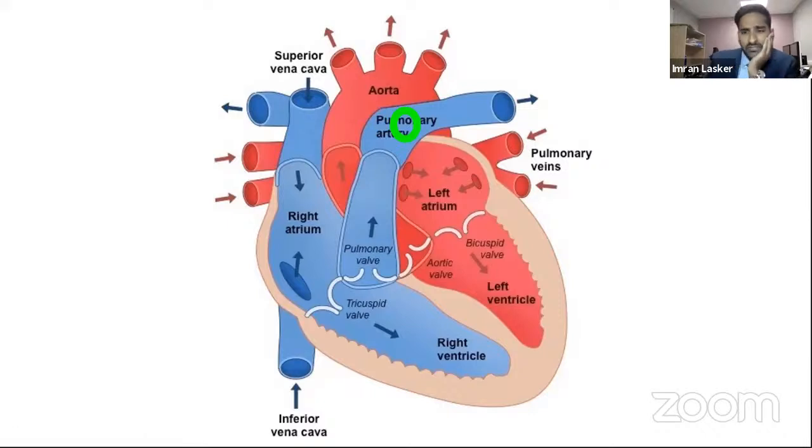Now, imagine if you had someone who's got an aortic dissection. You want a CT aorta, that's a different compartment altogether. But you've just gone and asked for a CTPA, but you've got an aortic dissection. Does that make sense? You're in the wrong part of the body with regards to the contrast. Contrast is just liquid that goes through the artery, it goes with the blood and carries on to whatever part of the body you want. So depending on the timing of the contrast, you get the kind of scan that you want. If you want a CT aortogram, you put your little signal there, you wait for the contrast to get there, and then you take a scan.